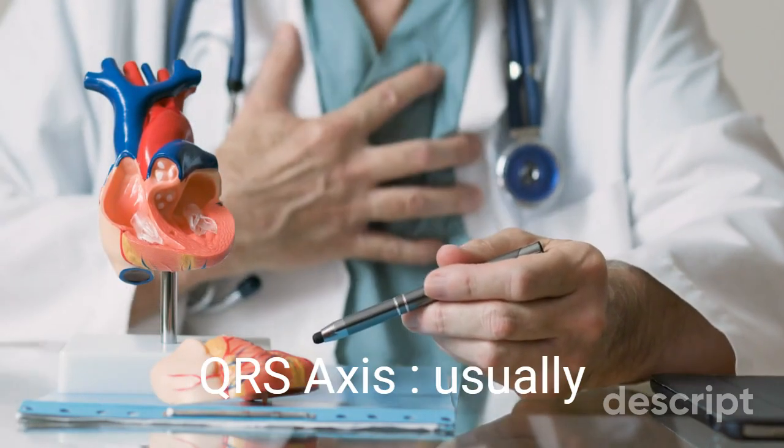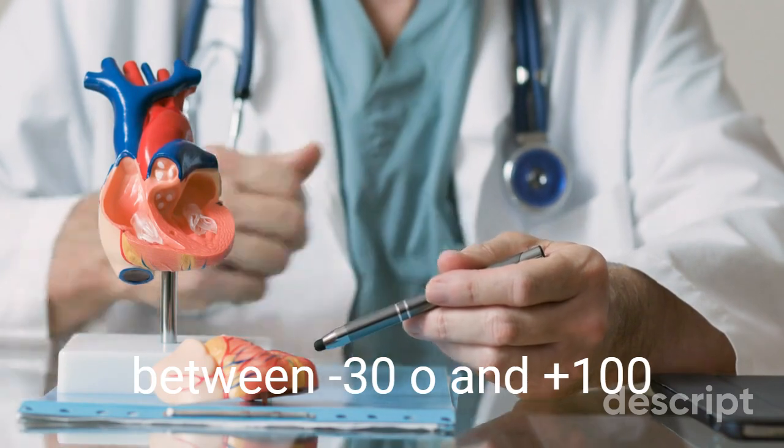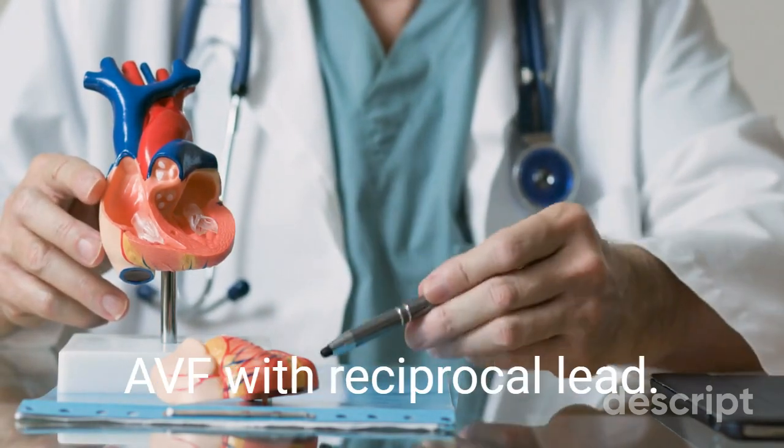4. Heart block. QRS axis is usually between -30 and +100, determined by lead I and aVF with reciprocal lead.